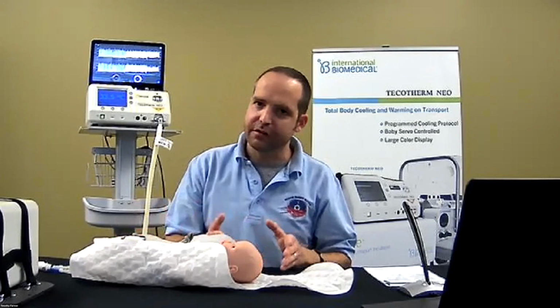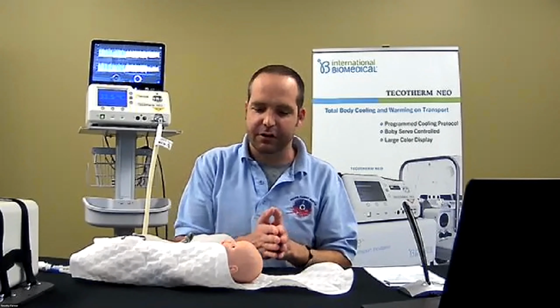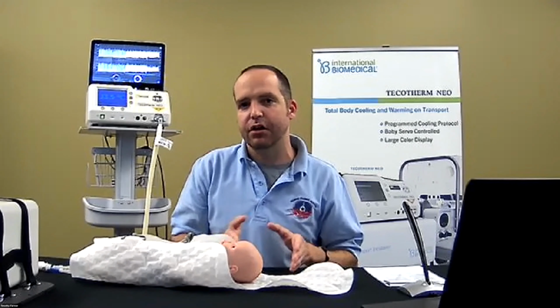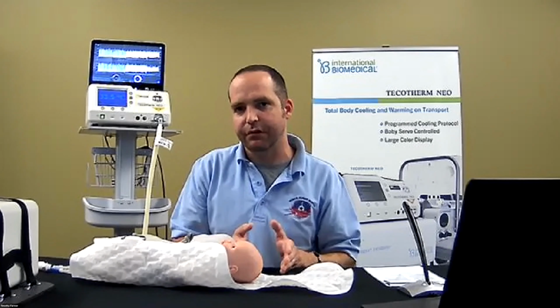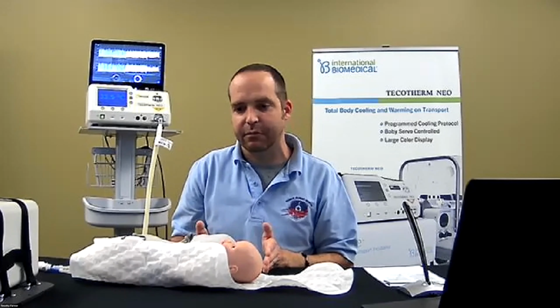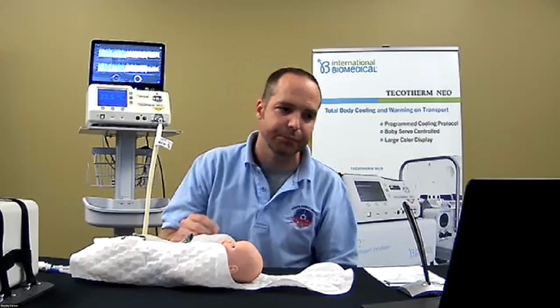But when we incorporated the Tecotherm, we needed to make sure we communicated with the bedside nurse that the therapy had started two hours prior, or an hour and a half prior, and that it was a seamless transition. For those of you using it in complete mode, with the Tecotherm being used in the unit, that's great. But for teams that might not be unit-based or are just dropping off at another NICU, making sure that communication is seamless has been a big benefit, so take the extra time when rolling out your initial education.